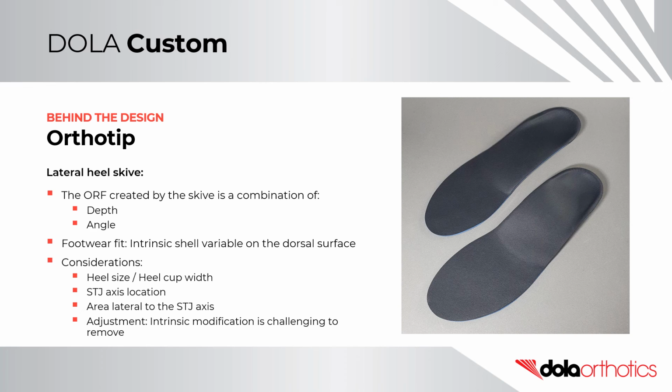Things to consider with the application of this prescription variable include the heel size or heel cup width, the subtalar joint axis location, the area lateral to the subtalar joint axis, and, as an intrinsic variable, it is challenging to remove or adjust.